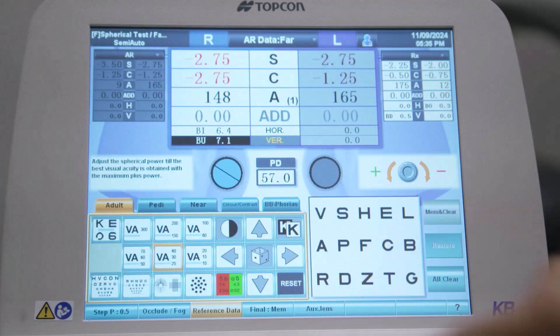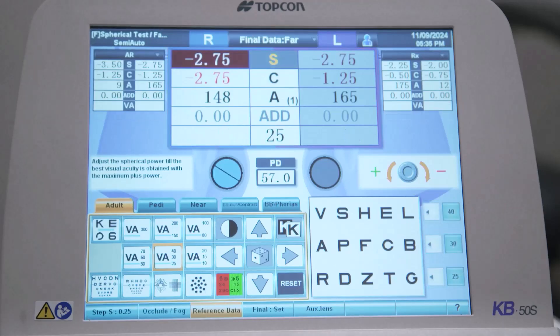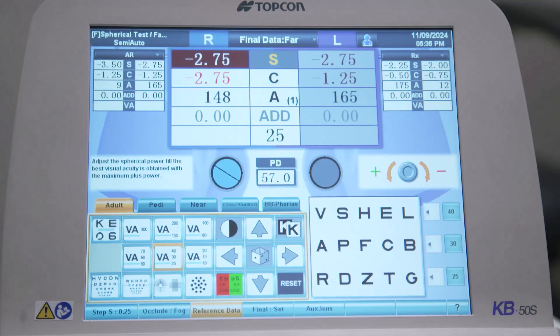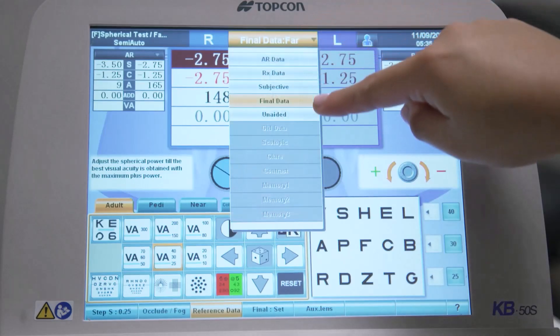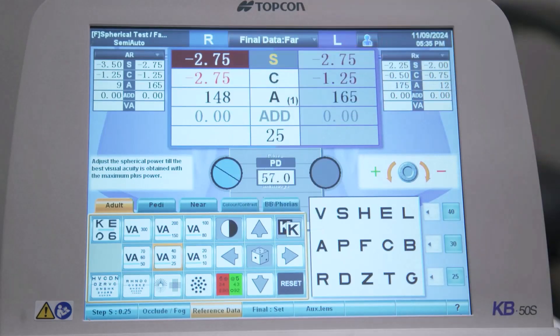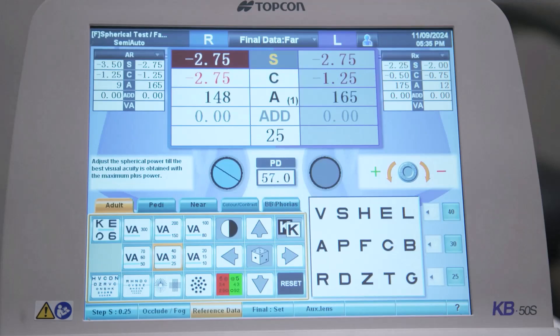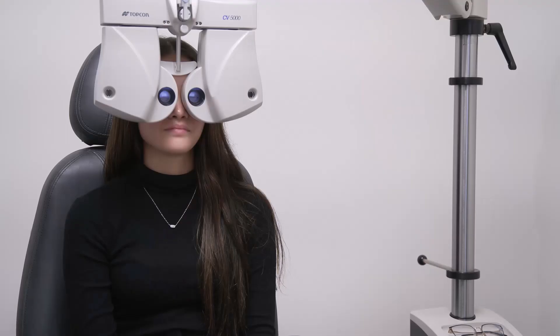The fourth button is the final memory button. Selecting this button at the end of the refraction saves the subjective refraction as the final result in the memory. Doing so allows adjustments to be made to the prescription without changing the final recorded subjective refraction results, and makes it quick and easy to switch between the final refraction and the previous spectacles. This allows the patient to appreciate the benefit of the new refraction.